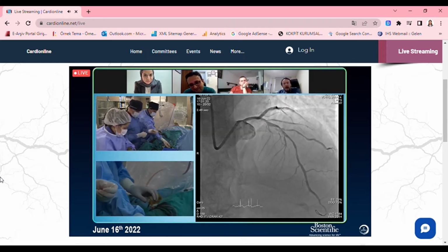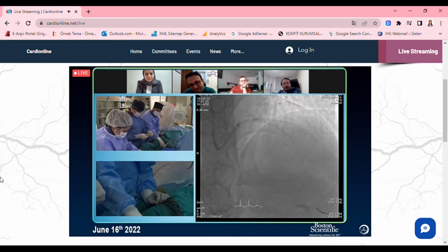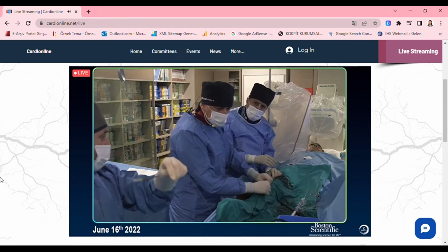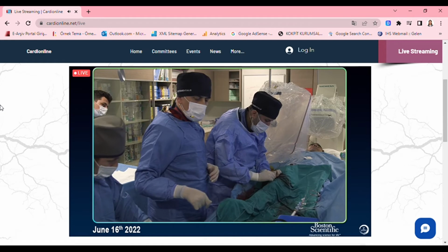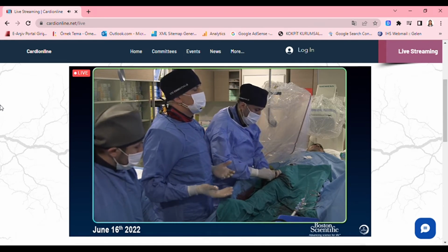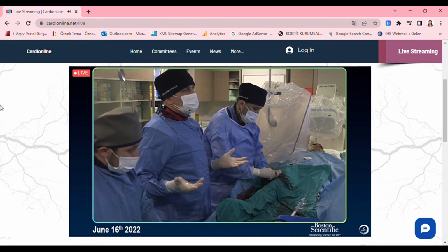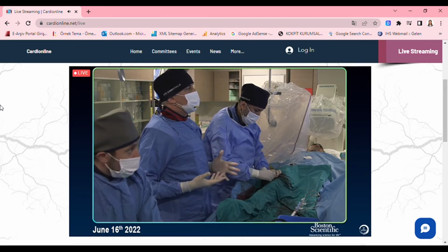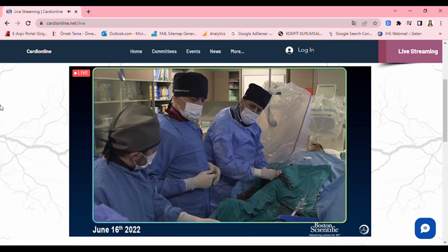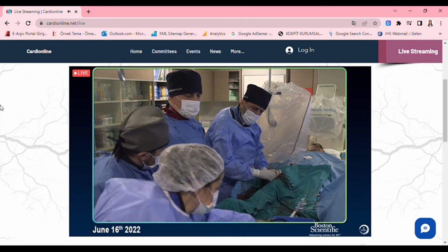What do you think about cutting the rotor wire and then working over the rotor wire? We know everything about how we can use them. We don't know if we would use it several times in a month. I agree. I just wanted to know whether anyone does it.